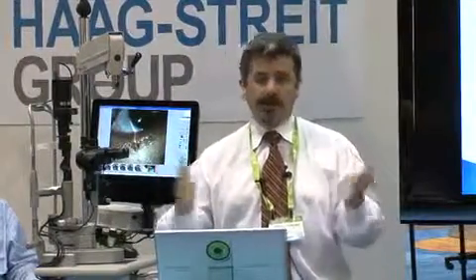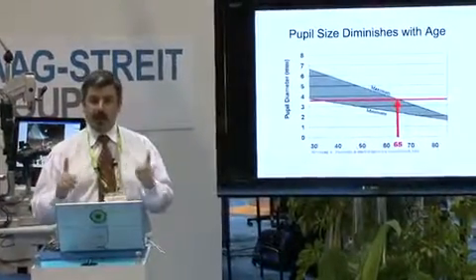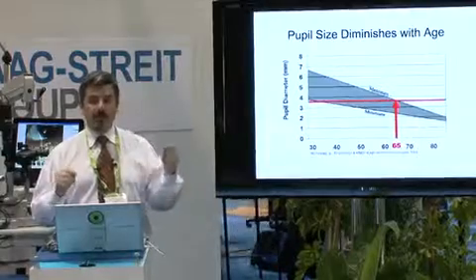The Technis multifocal is a full optic diffractive. All of the light is diffracted regardless of what part of the lens it passes through, and all of the light is split equally, 50-50, regardless of the size of the aperture. Most people have smaller pupils as they get older, but not everybody. And there are outliers, and that's where the LENSTAR can help.